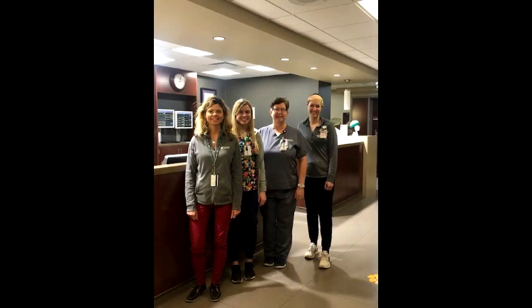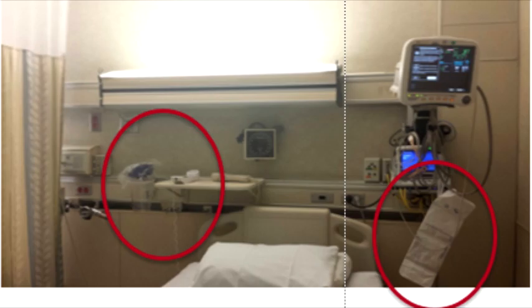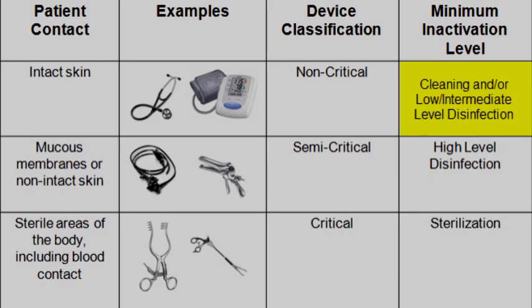Who can help? You. Today we are going to focus on reusable patient care equipment. Patient care equipment that is reusable must be cleaned and disinfected between uses. This includes items like glucometers, bladder scanners, and stethoscopes. How do we know what to do?